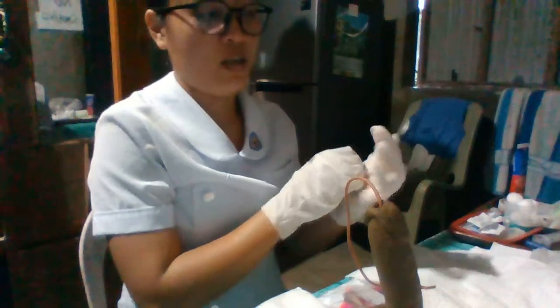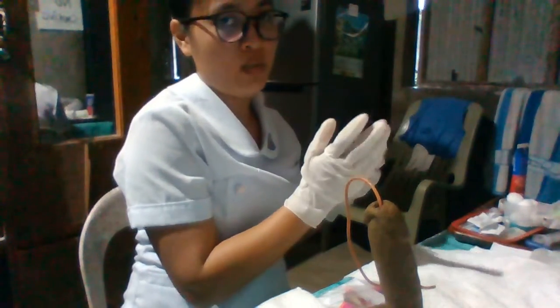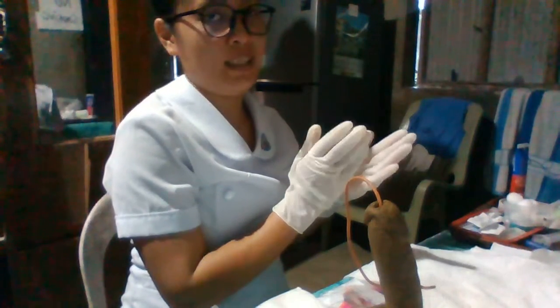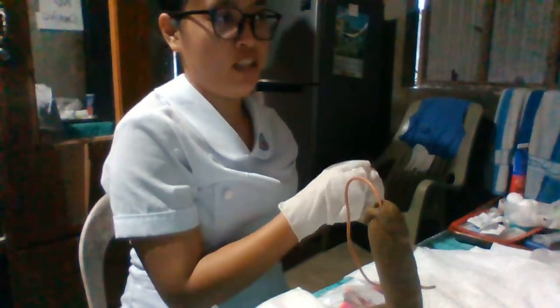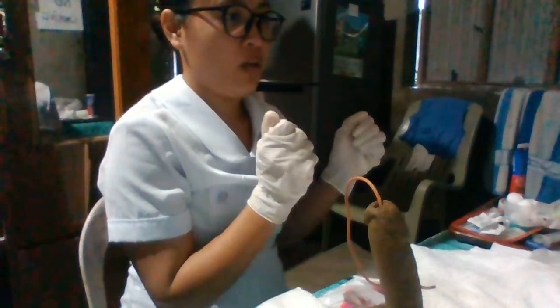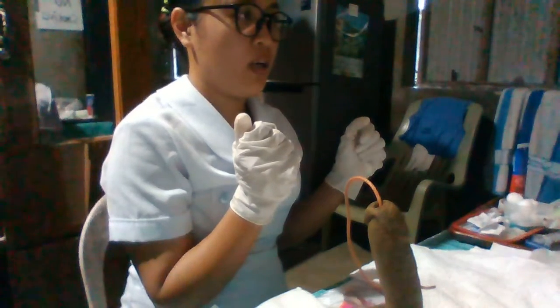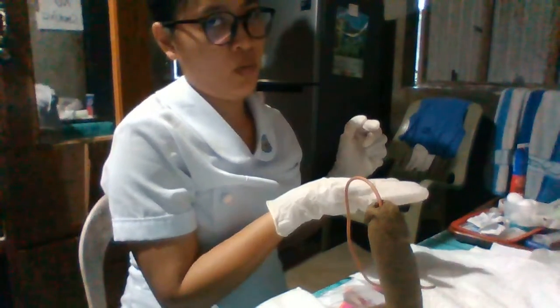Then next, we are going to pour antiseptic solution on cotton balls or swabs to know if the client has an allergy to the ointment that we are going to use.